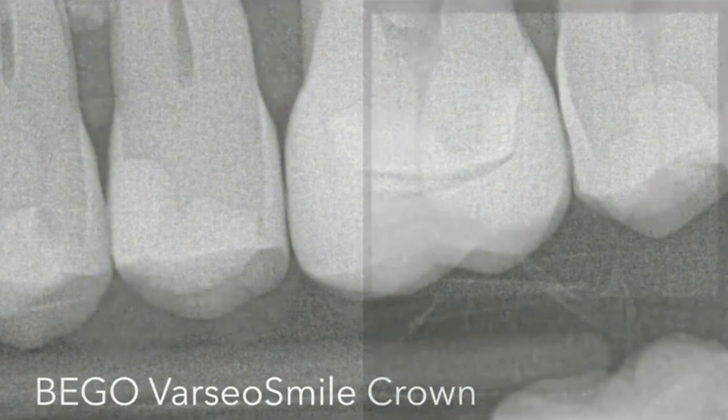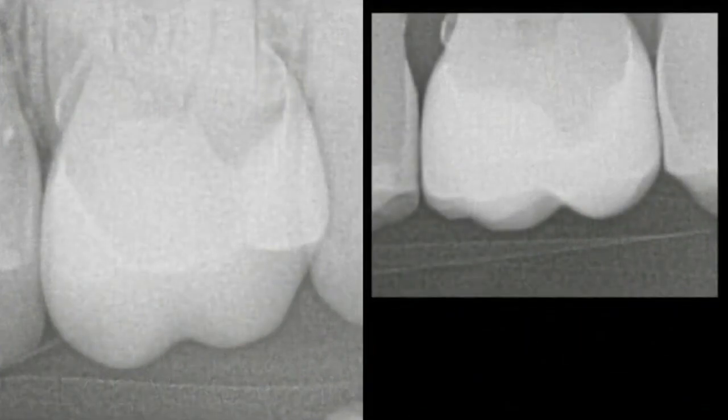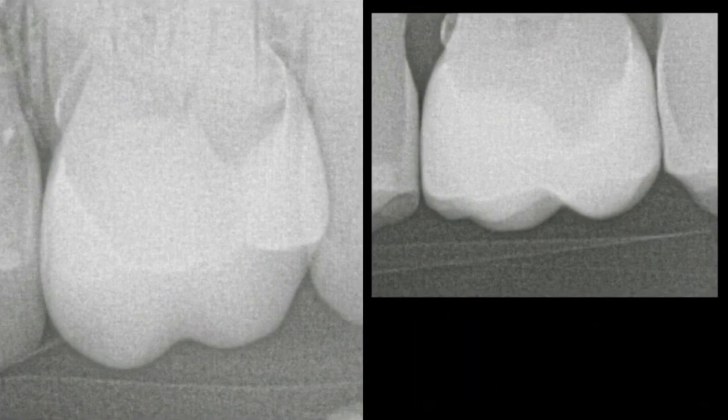Okay, and you can see how beautifully this restoration blends into the tooth. It looks literally like enamel. That's what it looks like. It looks like I replaced the enamel. And that's the other thing when it comes to the prep. The way it blends in is just beautiful. You really can't see the margin.